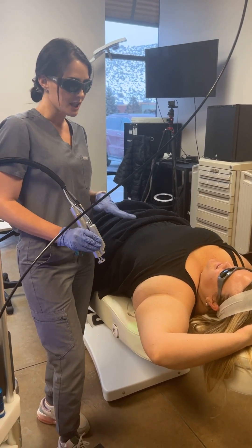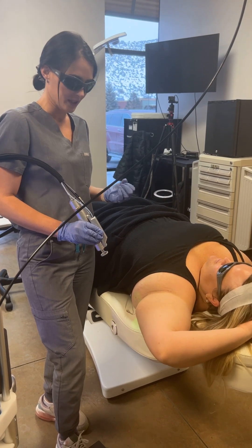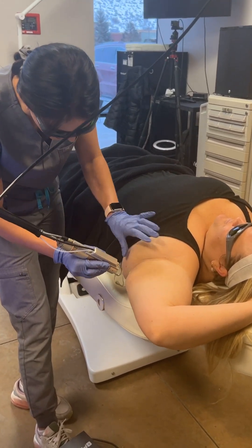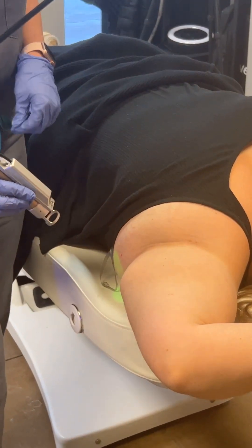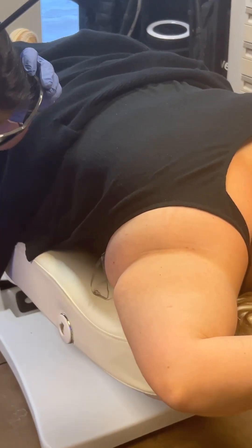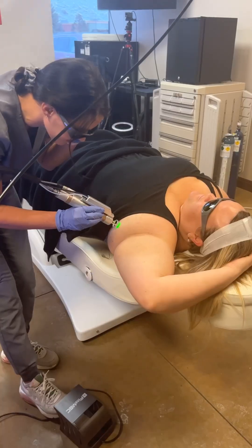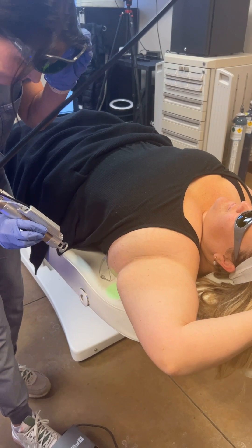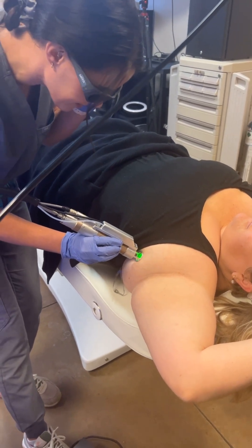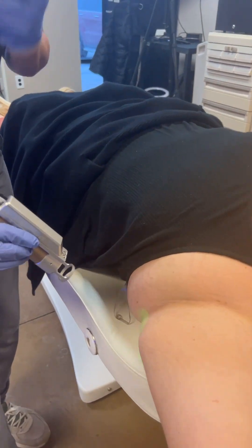I'm going to turn it up just a little bit because I want you to get a really good first treatment. So I'm going to do one more. One, two, three. One more. That just like popped out. Beautiful. So I'm going to go pretty quick — you let me know if you need me to break.